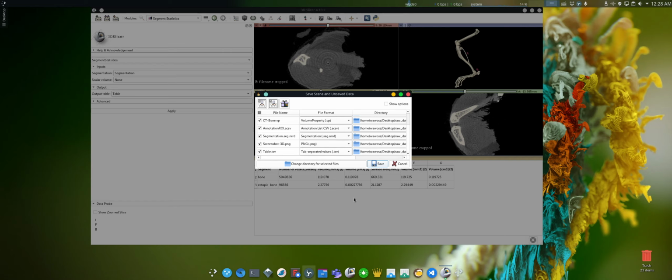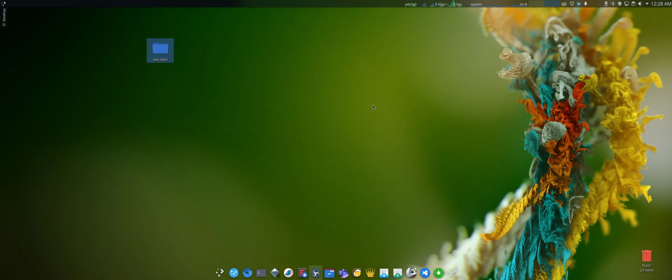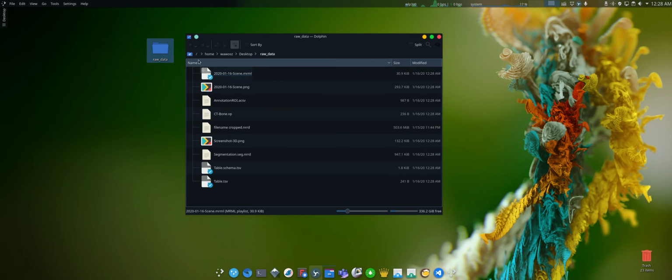And it will contain information from the segments of a volume. So let's save it. And after several seconds, it's a relatively quick process, all the data is already saved. So let's close Slicer. We don't need it anymore. And let's look at the content of our original folder.